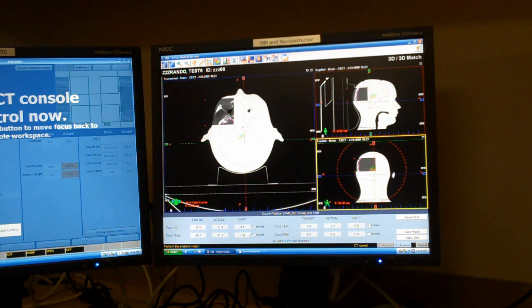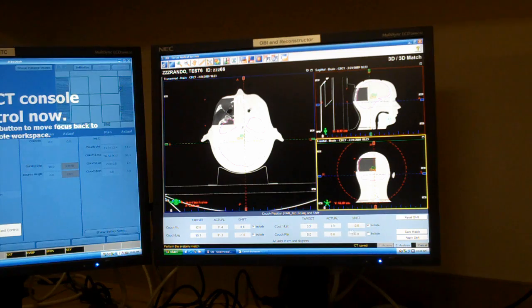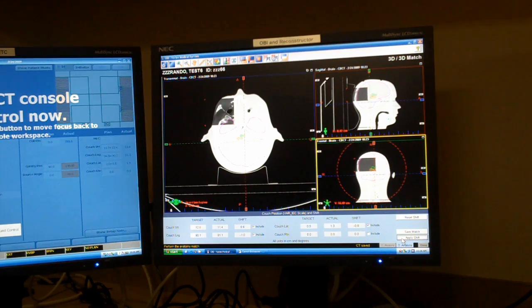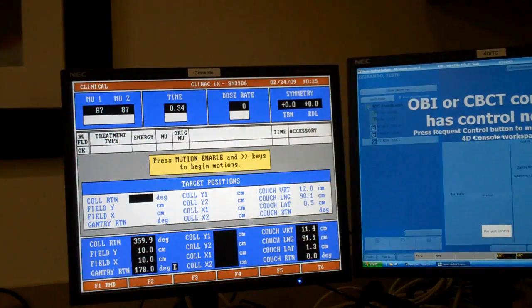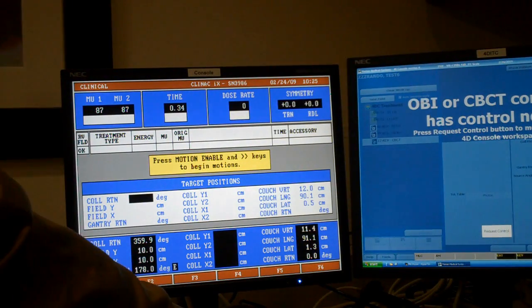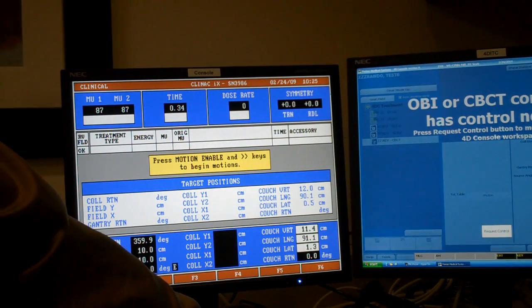Now when you click apply shift, which is .6, negative 1, .8. Again, it sends your new couch coordinates over to the console.